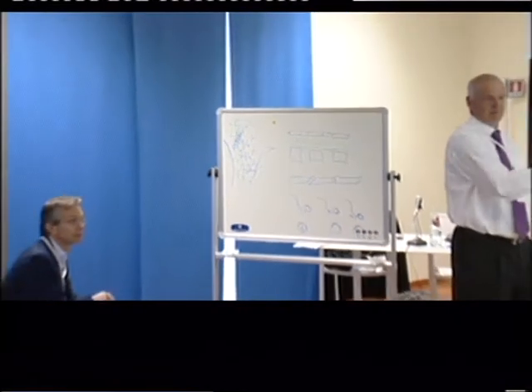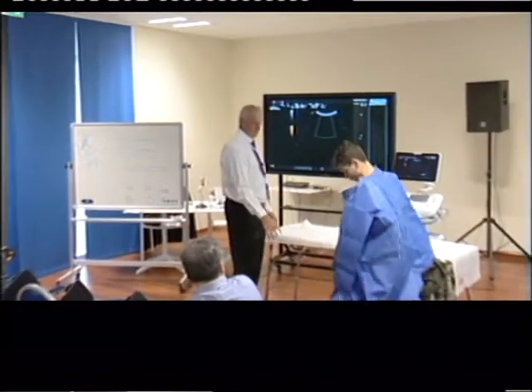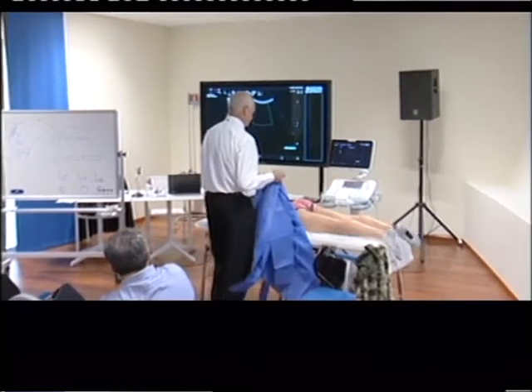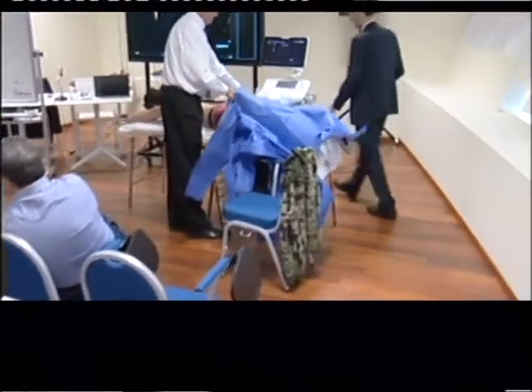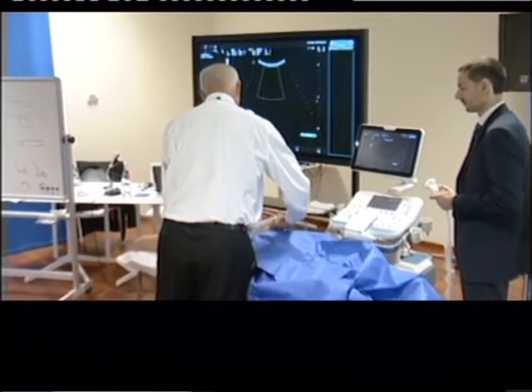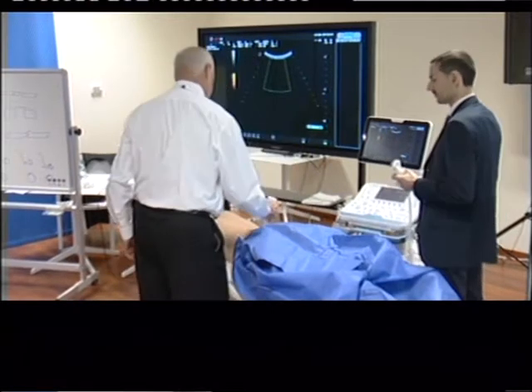Okay. The ultrasound guy, so he can control the machine. Okay, I call him. Cold.